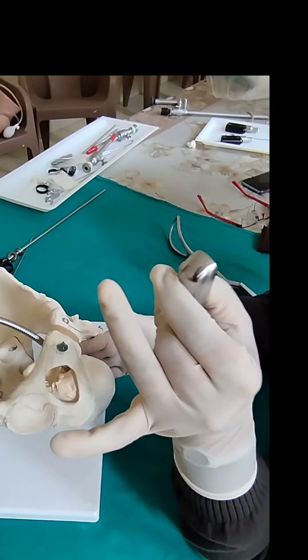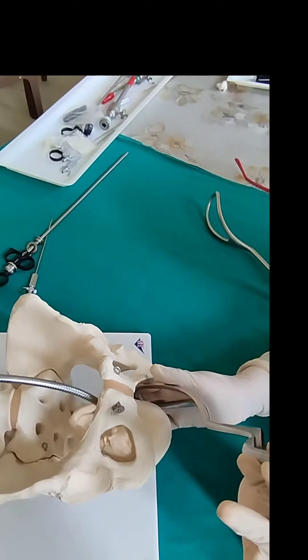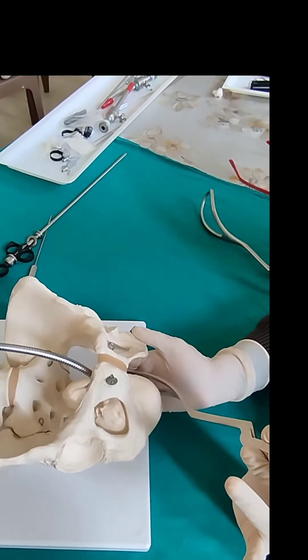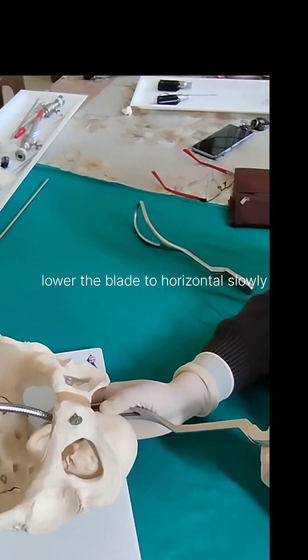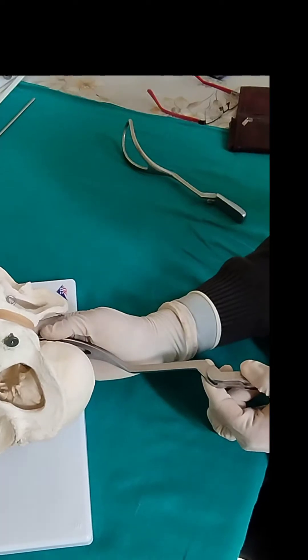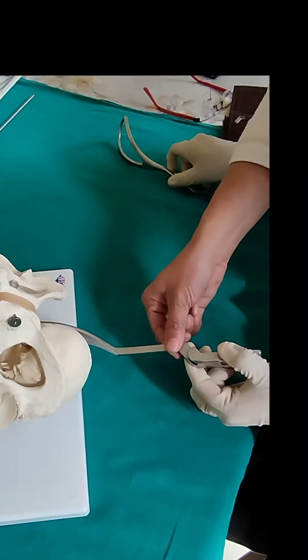Under the guidance of this right hand, we will insert the left sided blade of the instrument inside to make the blade reach up to the cheeks of the fetal head, and slowly lower it down like that. Ask the assistant to hold the blade.